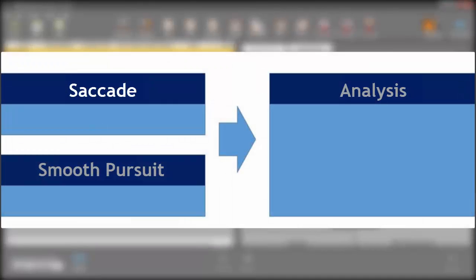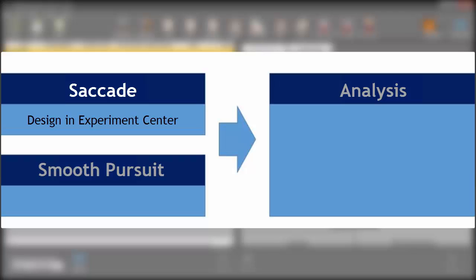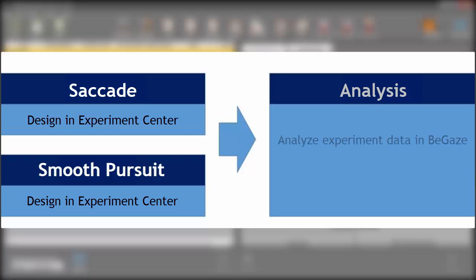In this tutorial, you'll first see how easy it is to design experiments based on both saccade and smooth pursuit tasks. Then, I'll show you how to analyze the experimental data with tailored tools in BeGaze.